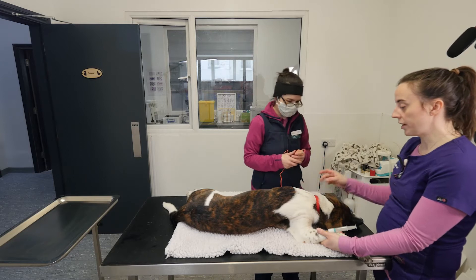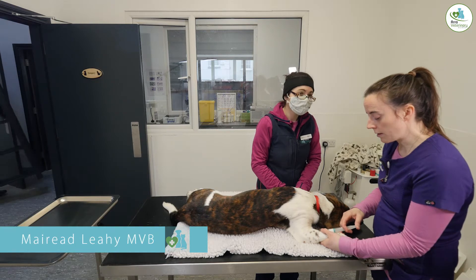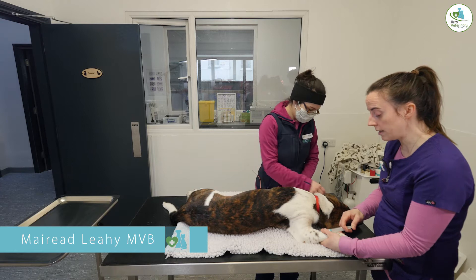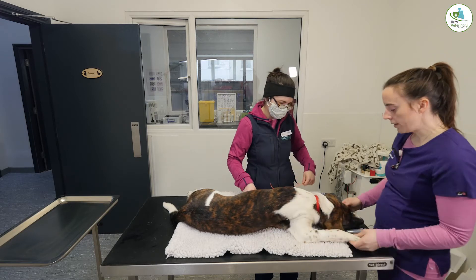We're now inducing an anesthetic, using the induction agent propofol. We're going to give that to him now and then we will place the ET tube.